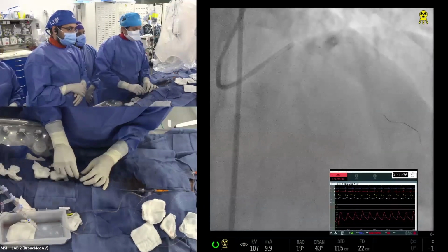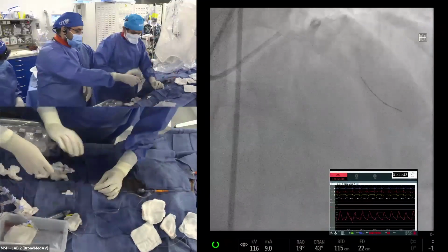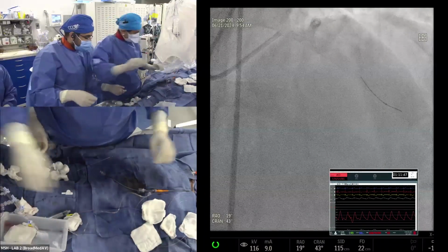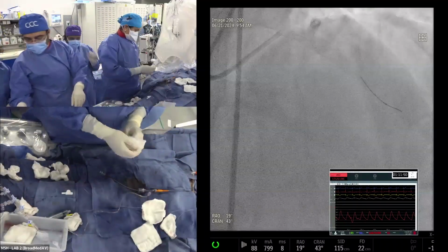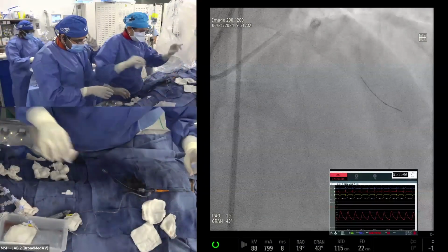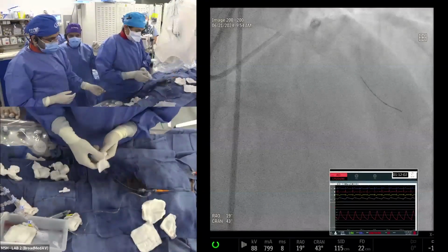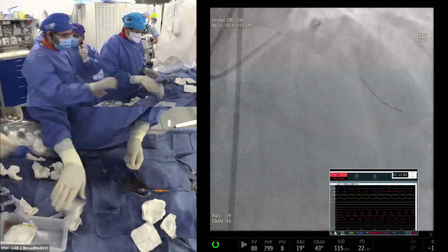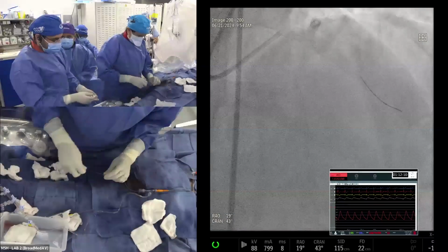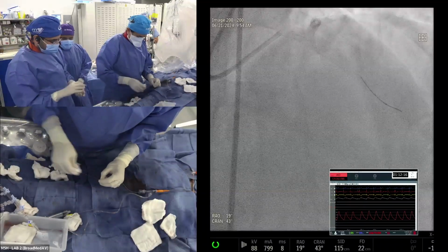Absolutely, very good point. Okay, so now we need a Fielder Fine Cross to cross it, and we are ready with the strategy, because this was a tight lesion. The rota will not go through this kind of lesion, even if the lesion is crossed with the rota tip. Remember, once you get to the spring, you go further and it stops because of the change in the wire. That spring tip is 0.014 and the rota wire by that time is 0.007, actually 0.009, but the tip almost becomes 0.005, 0.006. So that inertia makes the wire stop just at the spring tip. So this is our usual strategy.